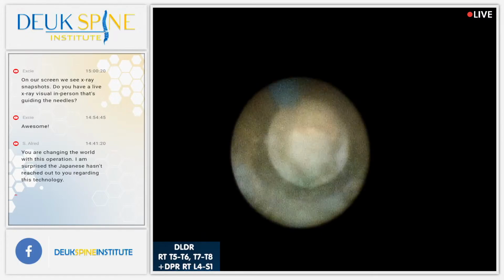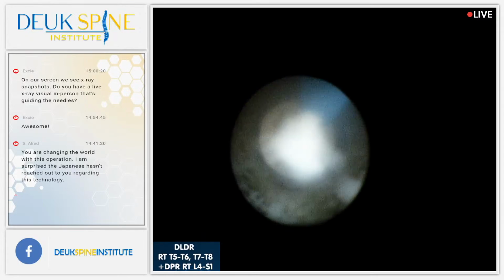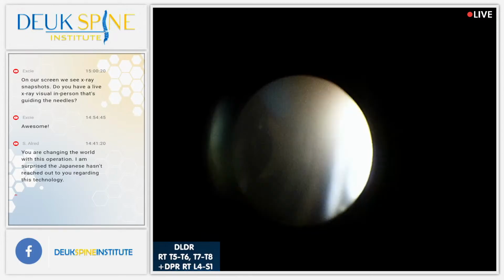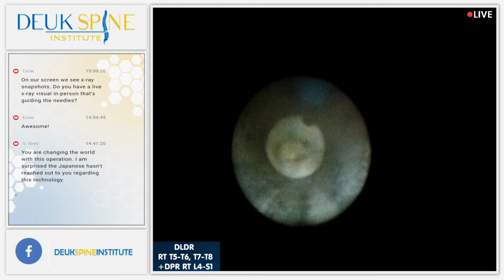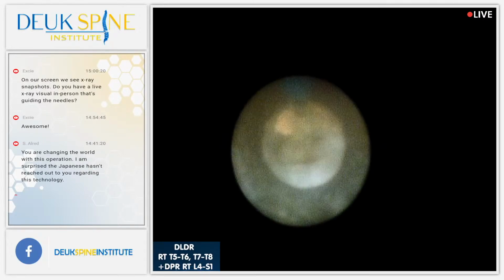The quality of images transmitted via fiber optics is not anywhere near as good as a rod lens type transmission, so the image quality is degraded. Do they make a rod lens scope smaller? Yes. I don't like it because it's still really big compared to this one.